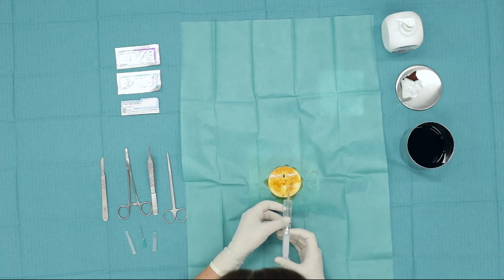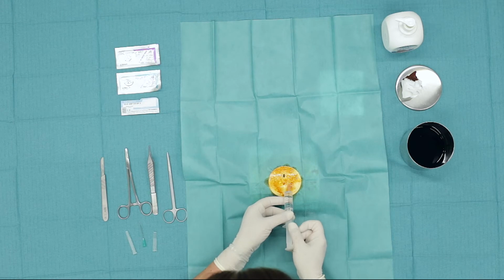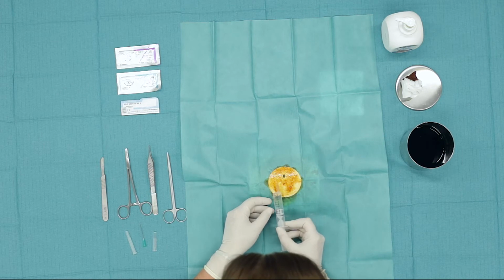In the same way on the other surface, the angle is always 45 degrees. The suction proceeds and the gradual administration of the formulation with parallel withdrawal of the needle. In this way we anesthetically cover the entire surface.